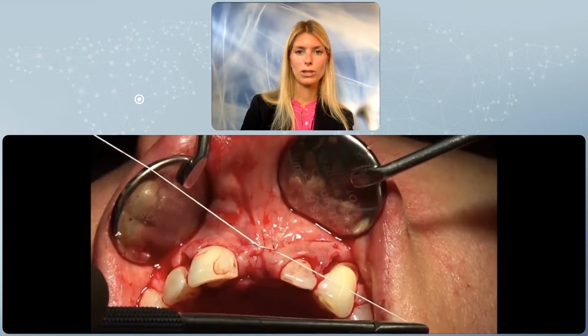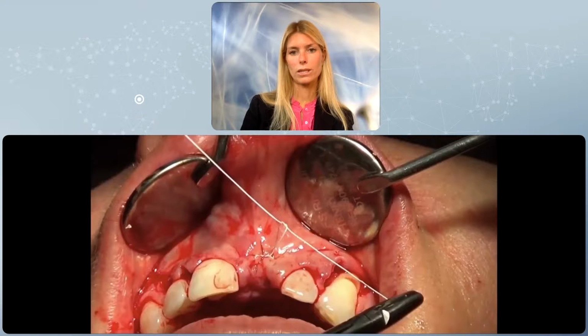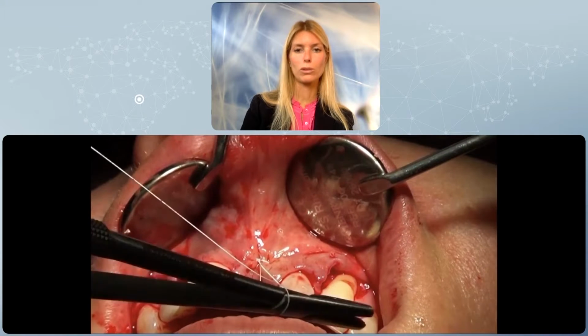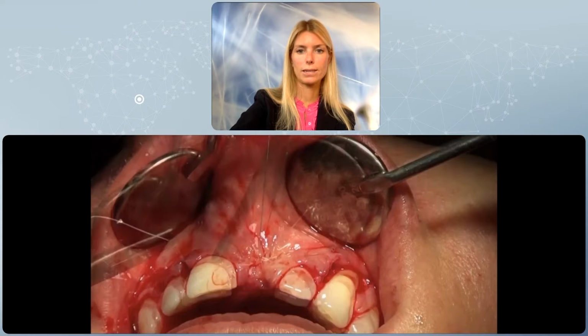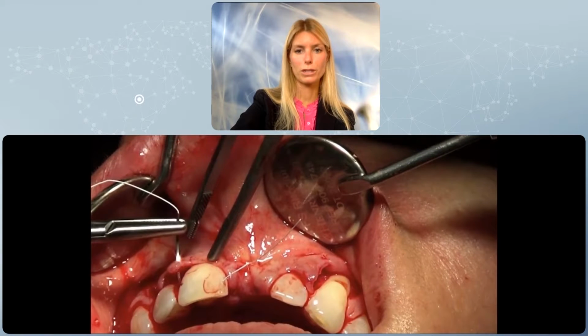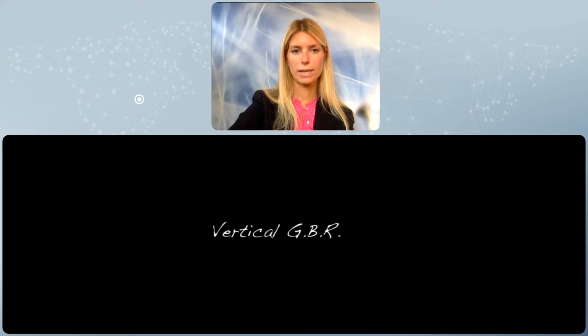And remember when I mentioned the 90 degrees incision between the crestal incision and the intrasulcular incision, it is to allow the papillas to be in the right position, being an aesthetic area, to be able to have a perfect closure. Now let's move into the more challenging scenarios, given that my lecture is about the severe cases.